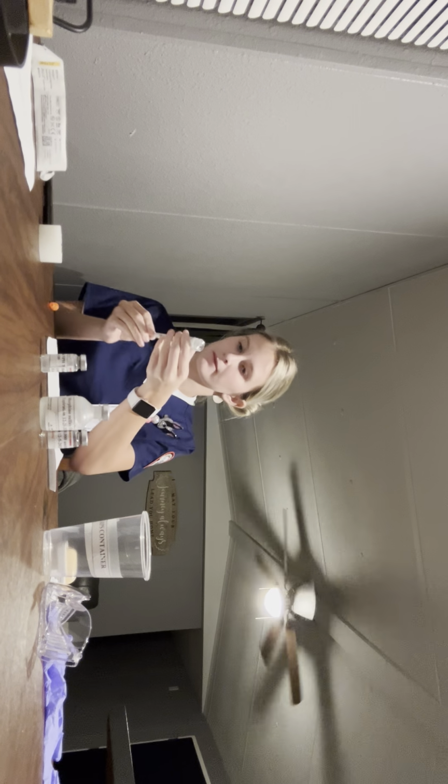Okay, so 10 units of insulin. I would also verify this with another nurse for medication dosage of insulin. So then I will swoosh to recap, and I'm done with that.